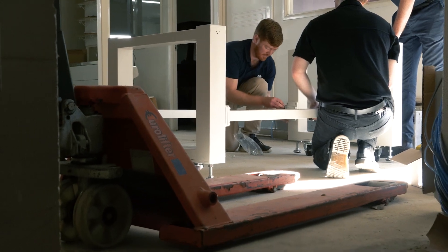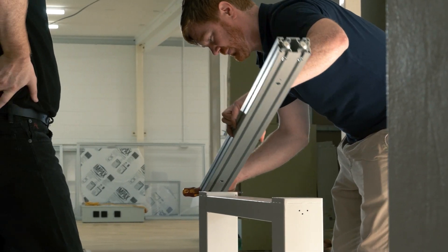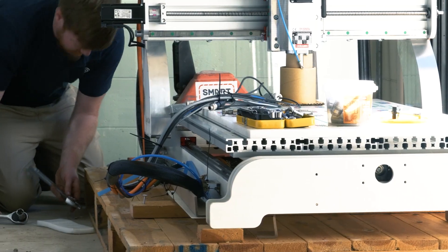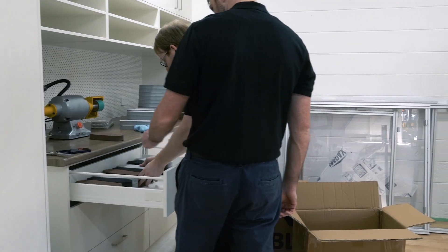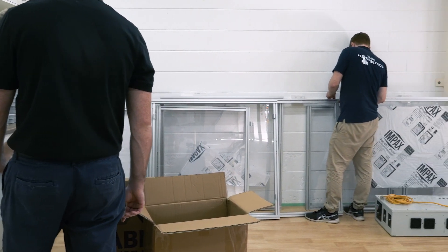That experience made me want to understand more about biomechanics and how an orthotic is designed and what goes into it. It led me into podiatry and now into orthotic manufacturing using the latest CNC milling with EVA. I'm really happy we've gone down this route — it's very exciting, always developing, and we're at the forefront of the newest technology.